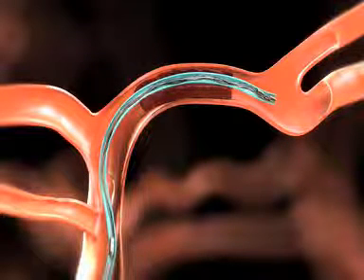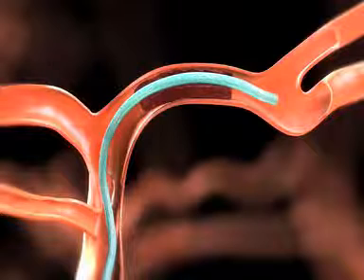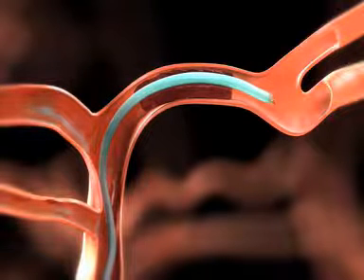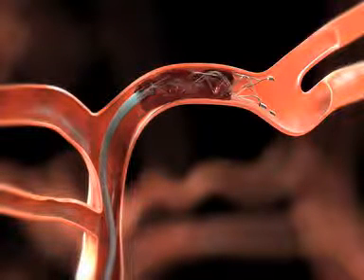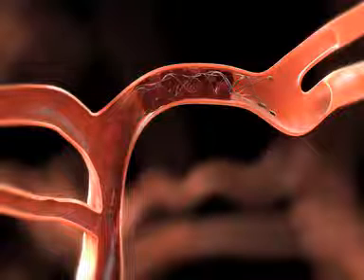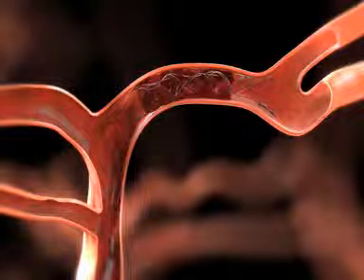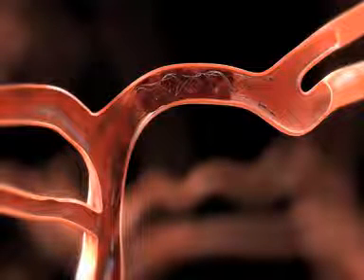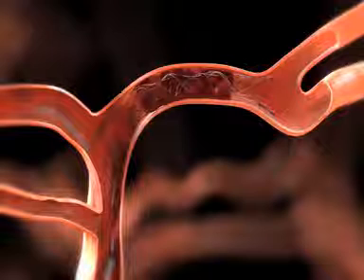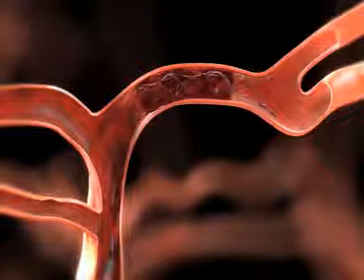loosen the RHV, then carefully withdraw the microcatheter while holding the Solitaire FR in place until the microcatheter tip covers only the proximal marker of the device. The usable length of the deployed Solitaire FR should extend past each side of the thrombus. Tighten the RHV around the microcatheter.